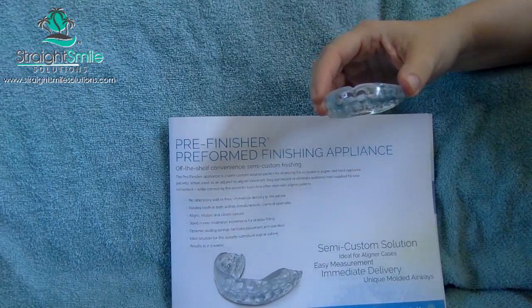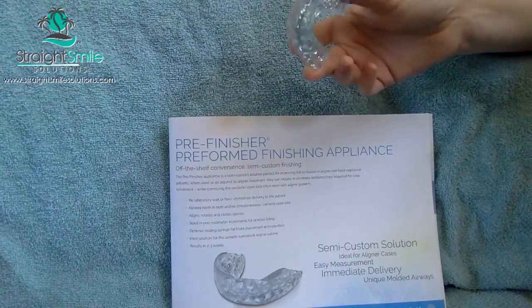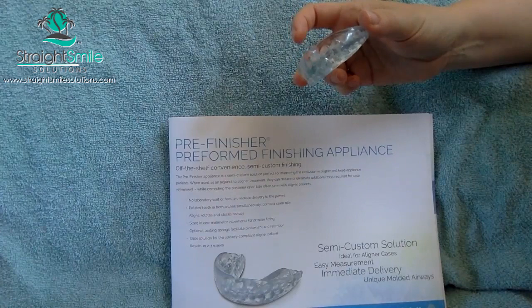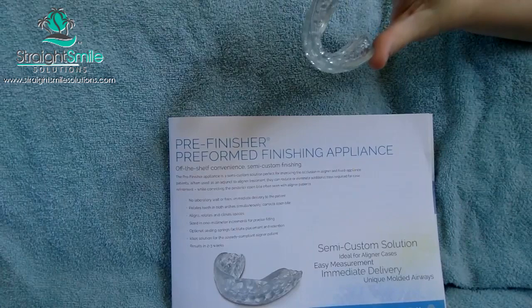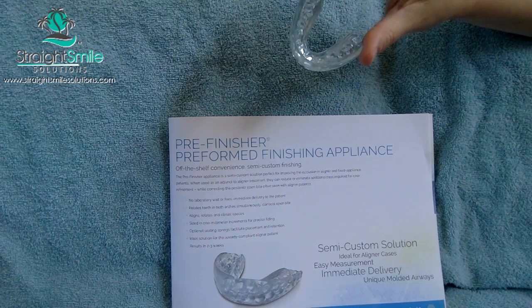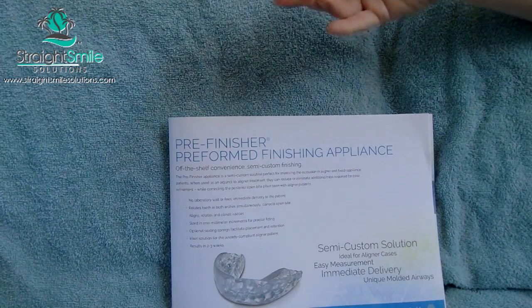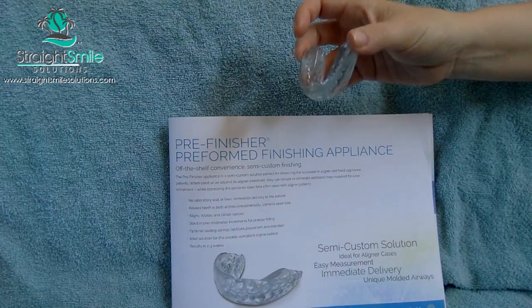Another alternative I received today is the TP Orthodontics pre-finisher. It comes in different sizes and you measure it similarly, but it has lower flanges and is a little more flexible. I do like that there are preformed slots. They also have a fully custom model where they'll set it up on a model — so if you have peg laterals or strange anatomy that doesn't fit a prefab size, you can have it made custom. They also have different appliances for extraction versus non-extraction cases. Comparing apples to apples, they're extremely similar appliances. However, with TP you can buy one at a time without taking a training course, which saves a lot of money.